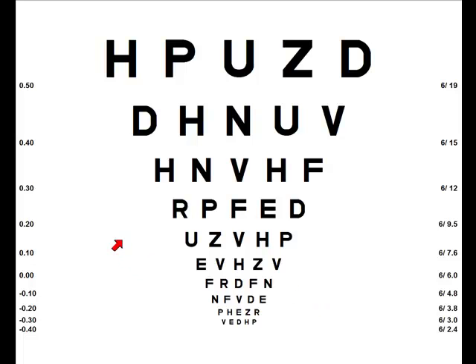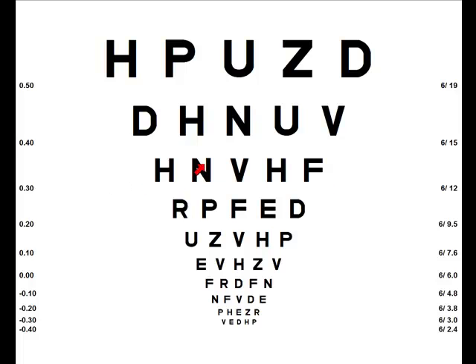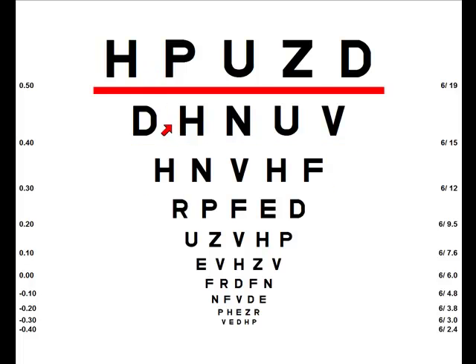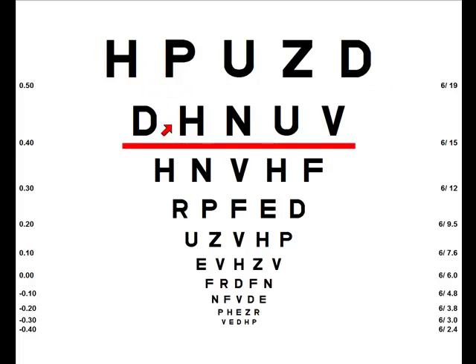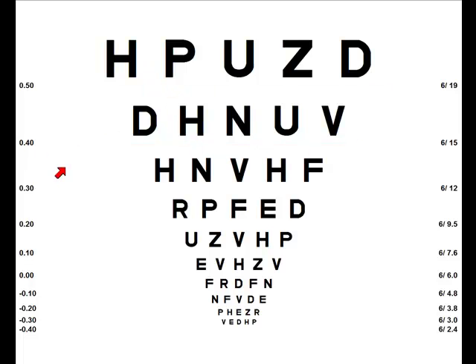You'll notice because I've clicked on the screen it's actually shown an arrow. If I click on the screen again that will disappear, and if I click it again it gives the standard Windows cursor. If I actually click on any of the rows of letters it will underline each row, and to get rid of that underlining just click away from the letters.